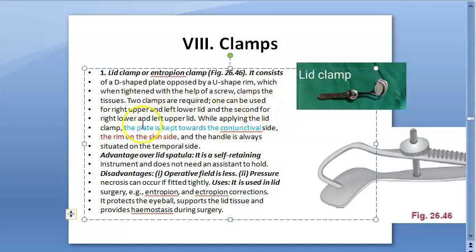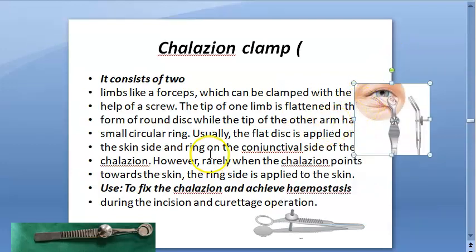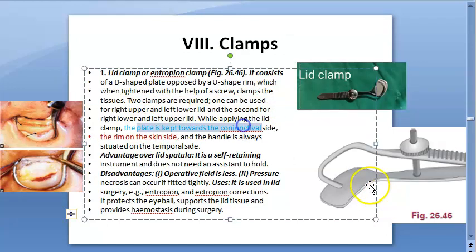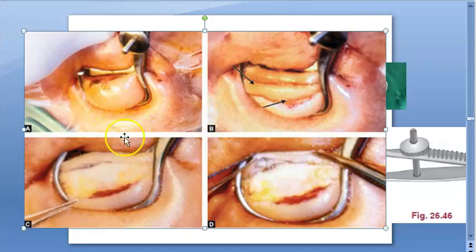The plate is kept towards the conjunctiva. Remember, this D-shaped plate is towards the conjunctiva. In a chalazion clamp, the open side is on the chalazion because you want to pierce and cut it. But here in the lid clamp, the D-shaped plate is towards the conjunctiva — the closed side — and the U-shaped rim is on the skin side.